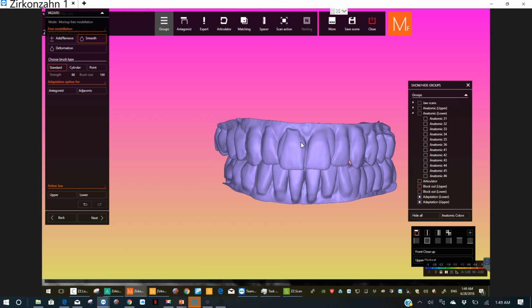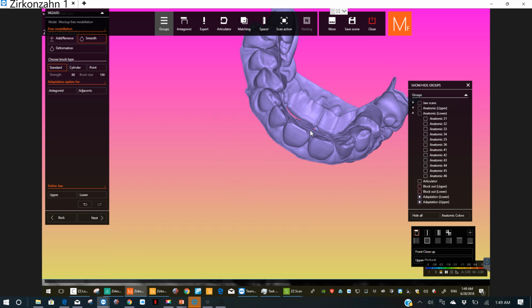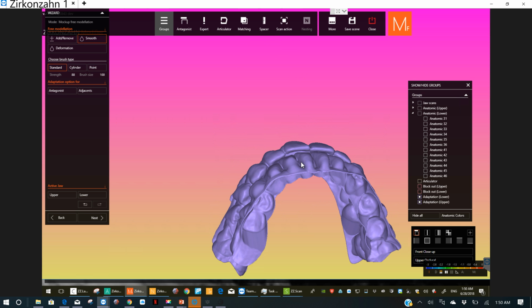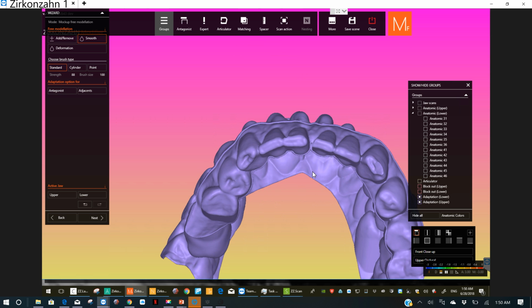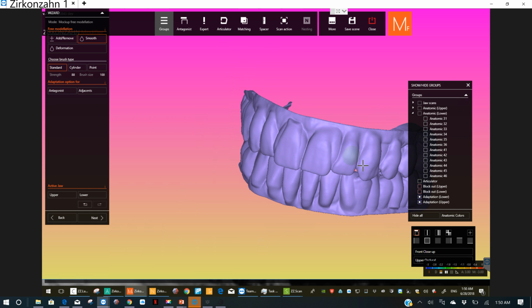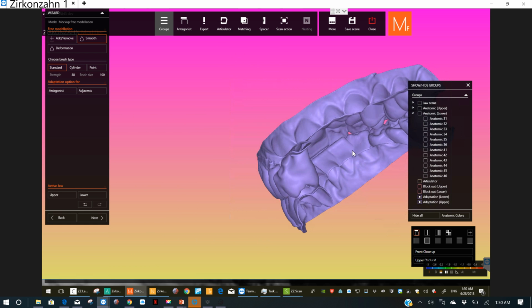And we have that little ledge there for strength. We could cut it off if we want to, but we need it there while we're trying it in. Maybe we just glue it in and leave it there too, but we want to be able to take it in and out as we adjust it. That's a key point. And possibly the patient takes it out as they get used to it.